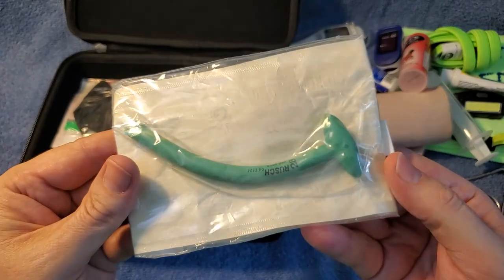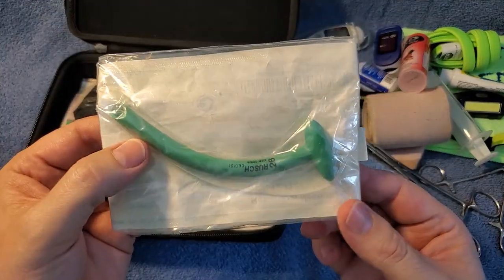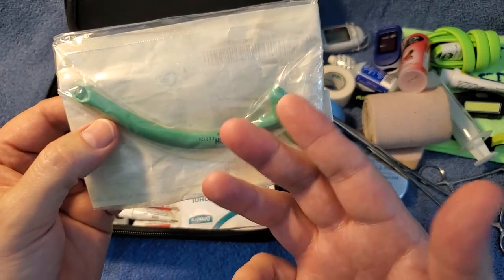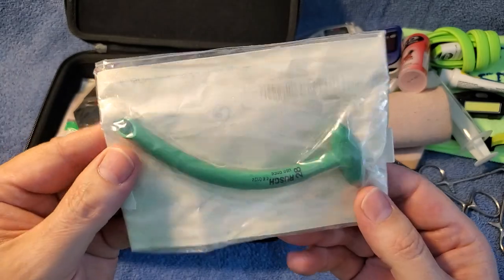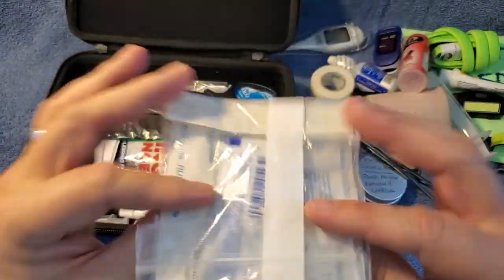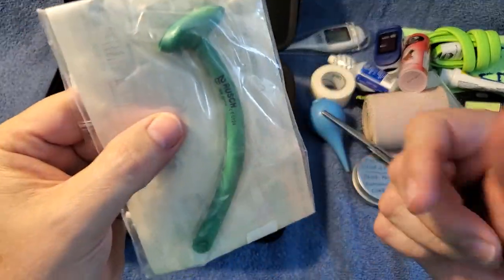This is a nose trumpet — a nasopharyngeal airway. It's for if someone's choking, or maybe they got stung by a bee and their throat swelled up and they can't breathe. You shove this down their nose to give them an air passage to their airway. It comes with a little saline pack — you grease it up so it slides down their nose and you can save a life.